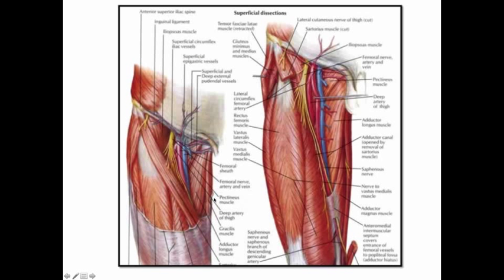And then lastly, the femoral vein lies medial to the artery. What's important to remember here is to keep in mind where the inguinal ligament is. I have seen cases where we've had retroperitoneal punctures, going over the inguinal ligament through the belly and then to the vein, which is not ideal, of course. So again, be aware of where you are in the anatomy and be a couple centimeters away from the inguinal ligament.